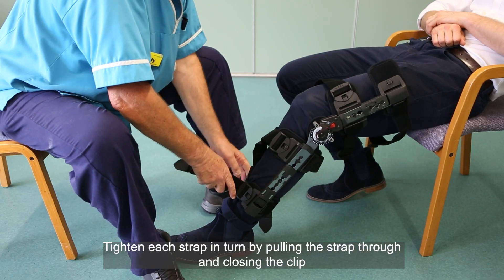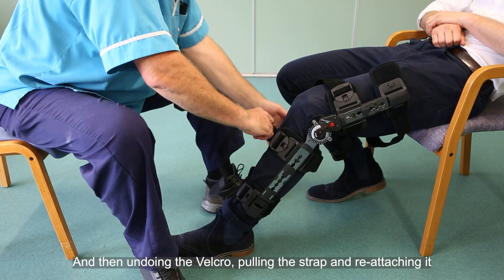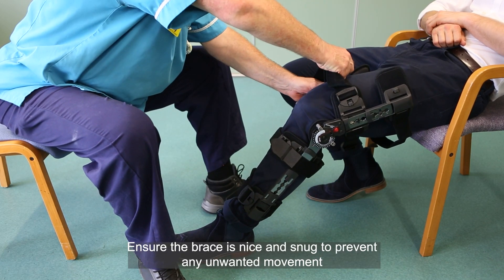Tighten each strap in turn by pulling the strap through and closing the clip, and then undoing the velcro, pulling the strap and reattaching it. Ensure the brace is nice and snug to prevent any unwanted movement.